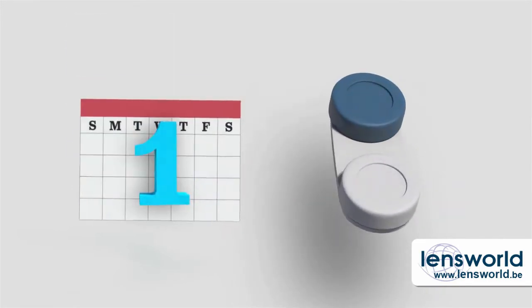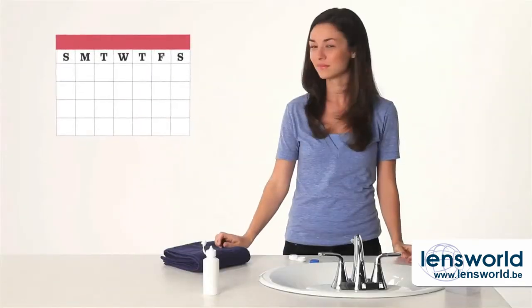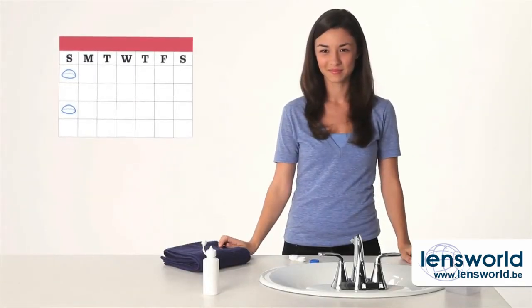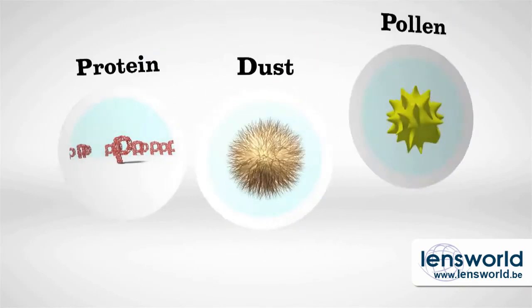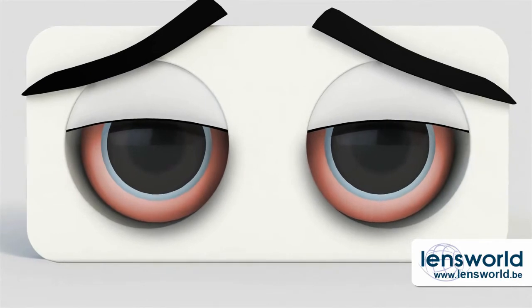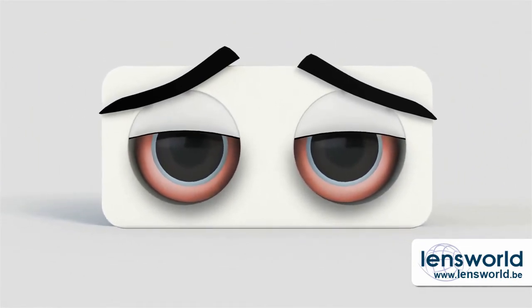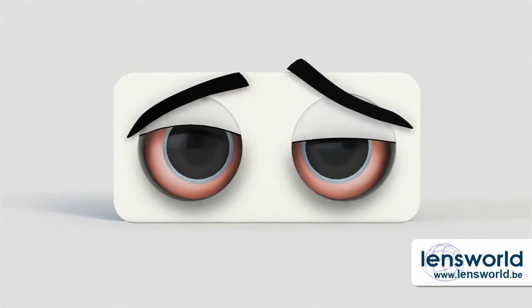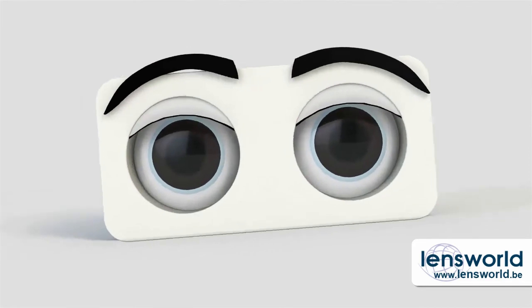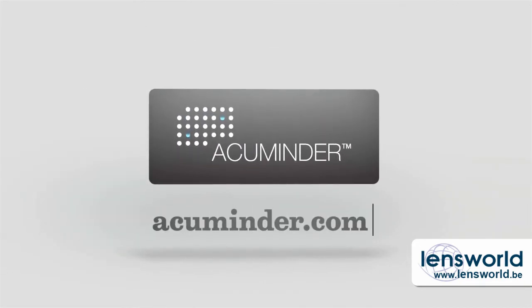You'll want to replace your contact lens case every three months or so. And this is very important: when it's time to switch to a fresh pair of lenses, be sure to stick to the schedule your eye doctor gave you. Over time, the proteins in your tears slowly build up on your contacts — so do dust and pollen. If you wear your lenses longer than you're supposed to, your eyes will look red and tired, they'll be itchy and irritated, and you won't be seeing your best. A fresh lens is a better lens. If you need help keeping track, you can sign up for free reminders from AccuMinder.